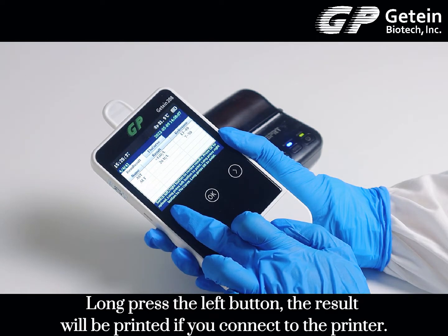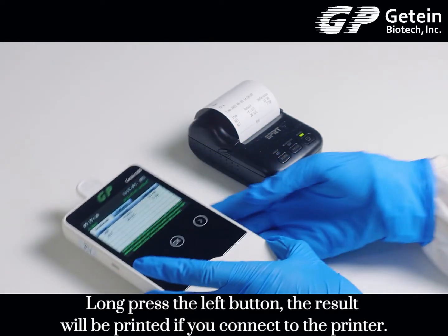Now press the left button. The result will be printed if you are connected to a printer.